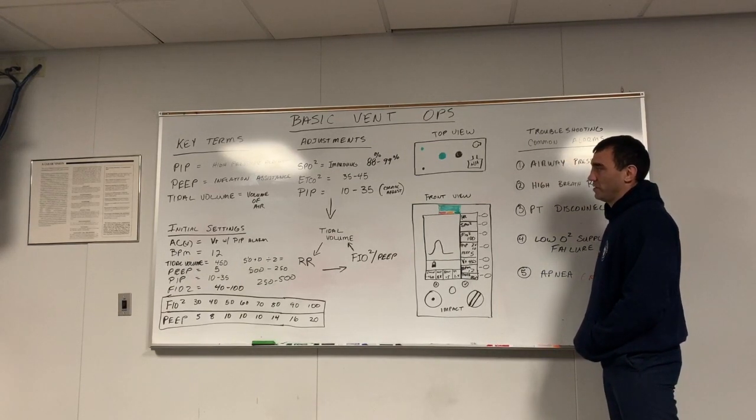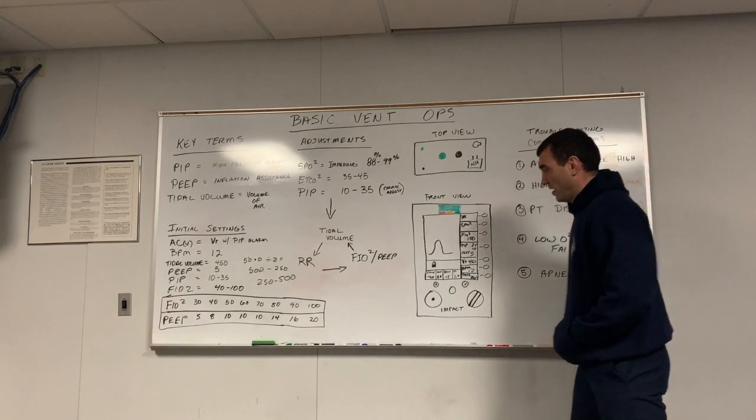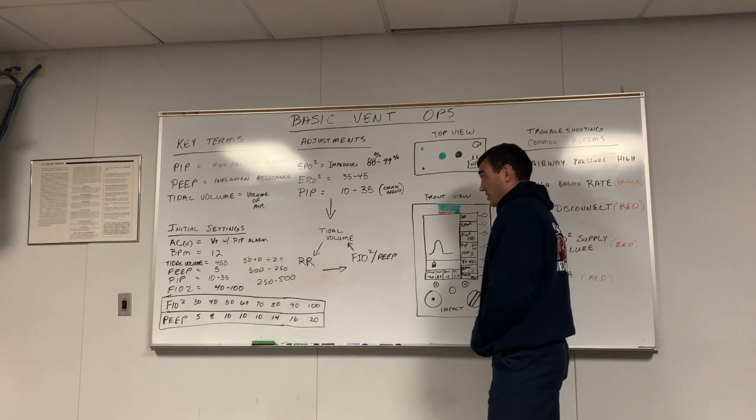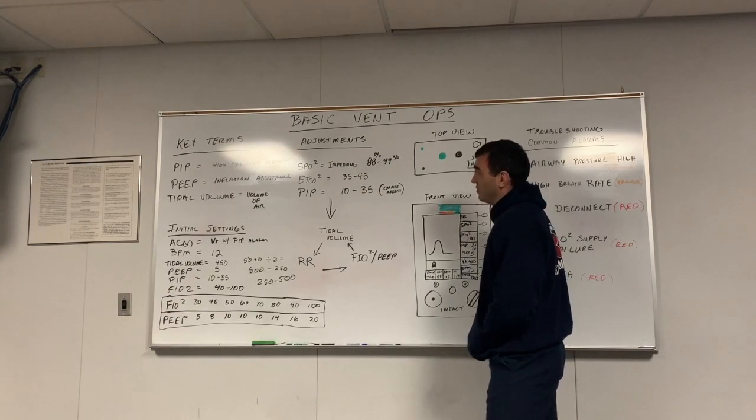That's obviously going to be adjusting based on what kind of patient we have. There's a lot of conditions, respiratory and metabolic, that can cause that to be different. Okay, but that's my goal. If I'm looking at what before I drop this patient at the hospital, I would like to be in that range.